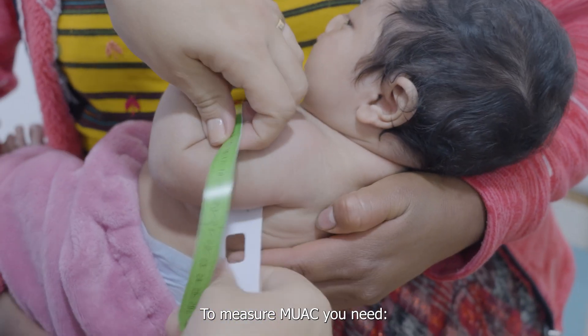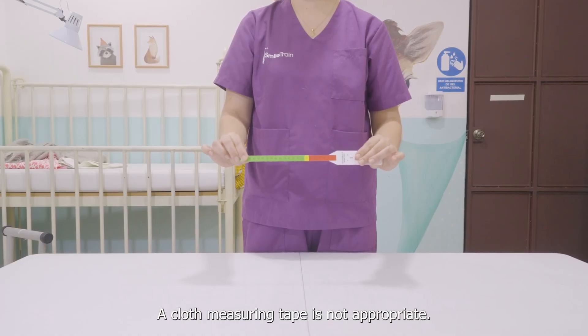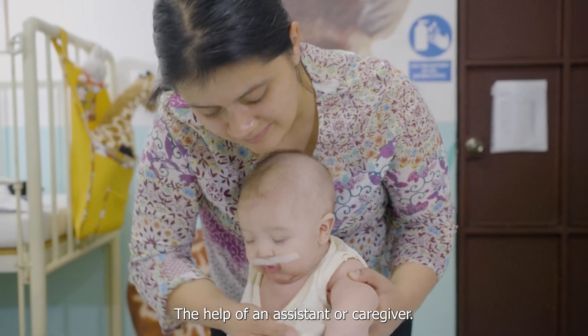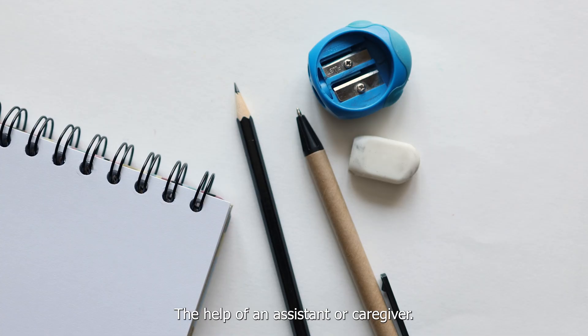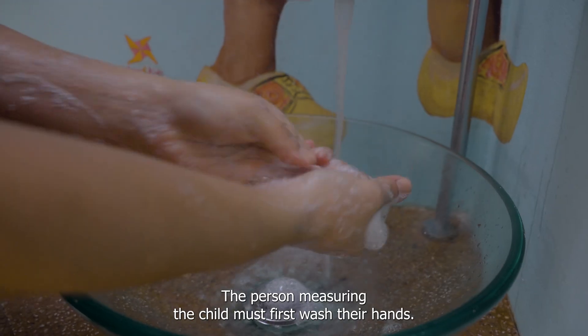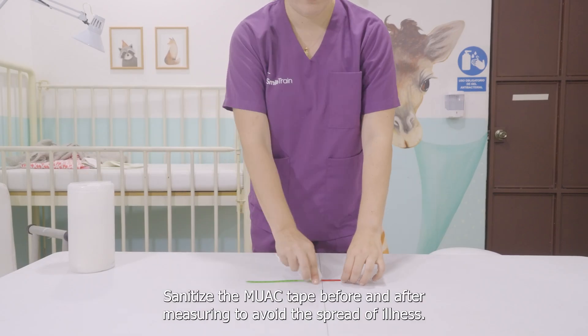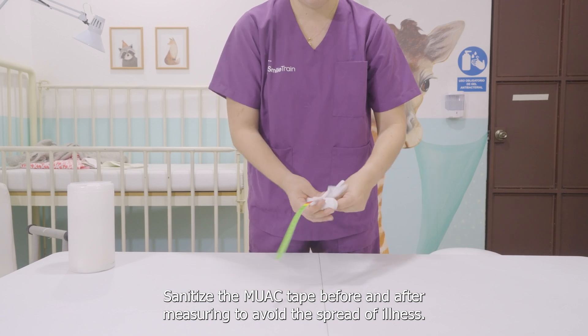To measure MUAC, you need a non-elastic MUAC tape — a cloth measuring tape is not appropriate — the help of an assistant or caregiver, a pen, and a MUAC growth chart. The person measuring the child must first wash their hands. Sanitize the MUAC tape before and after measuring to avoid the spread of illness.